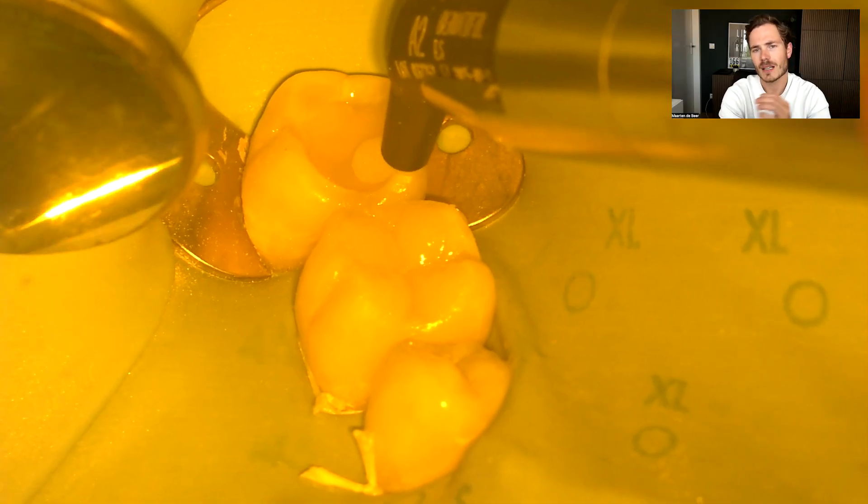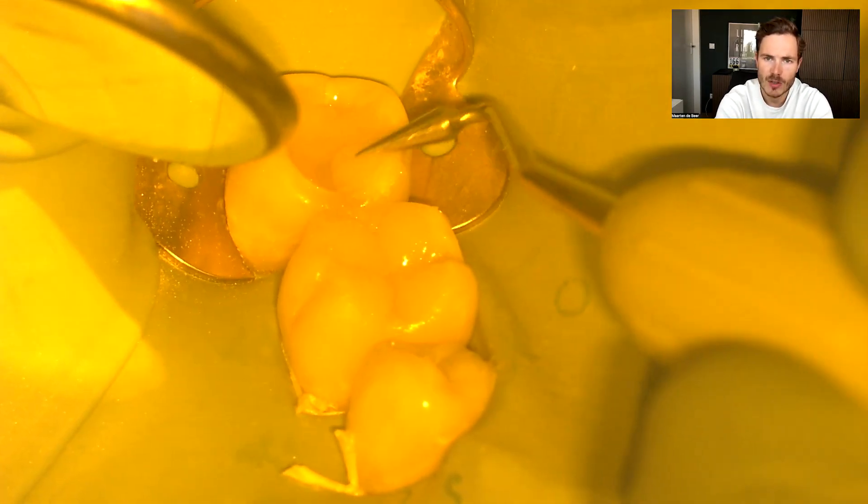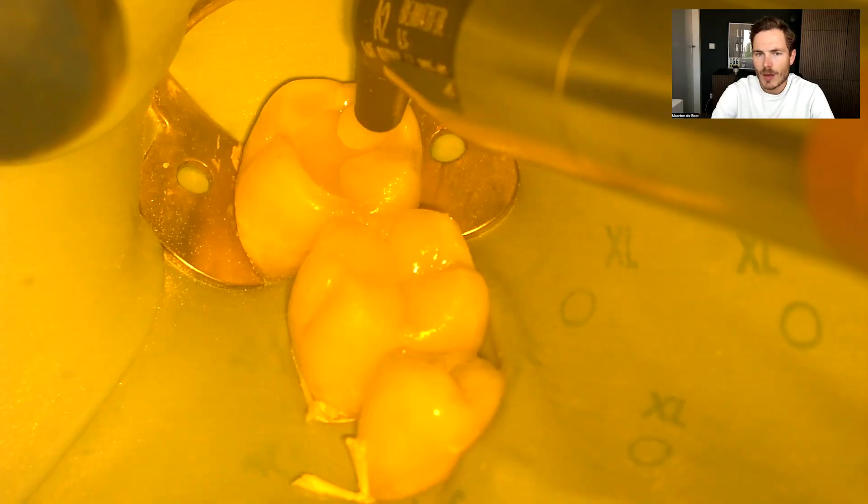Then we continue to the second molar, which is often quite easy. When we look at the fissure pattern it's more like a cross, so every cusp is roughly the same width and length — we can divide it into quarters, with each cusp covering around 25% of the entire occlusal surface. It doesn't really matter which cusp you start with on the second molar. Sometimes we have a more elaborate fissure pattern based on the position of the cusps and the indentations in the ridges, but usually a simple cross with four equal cusps is more than enough to get a nicely looking restoration.